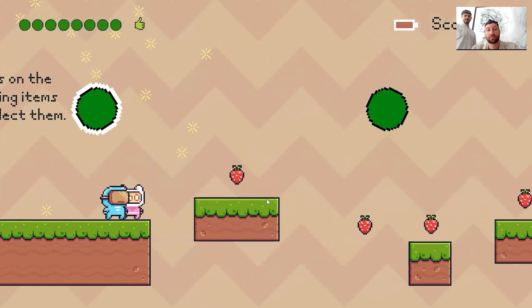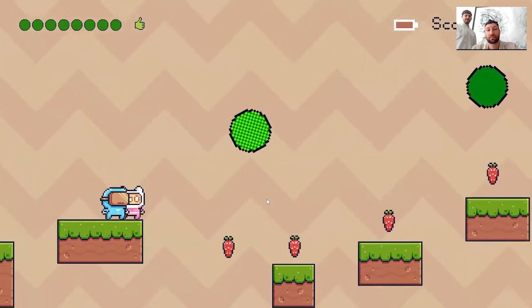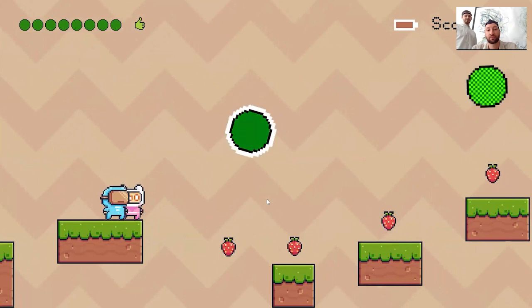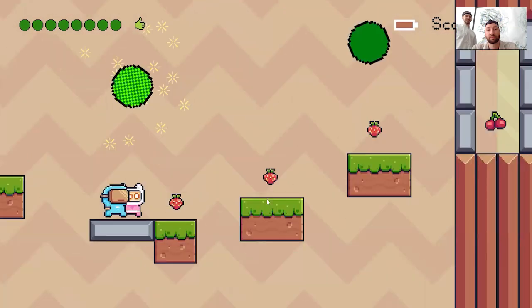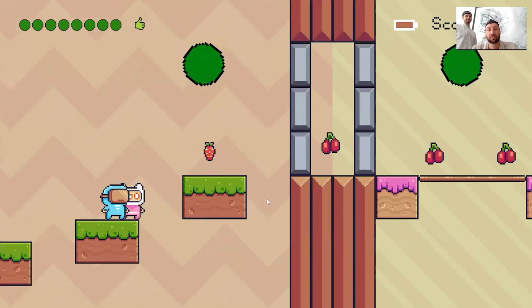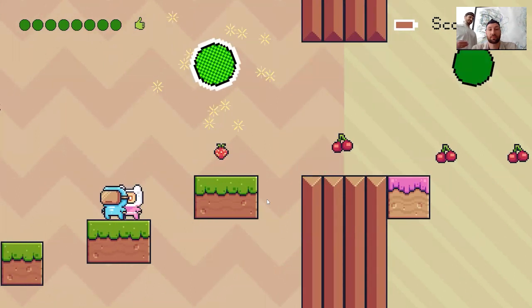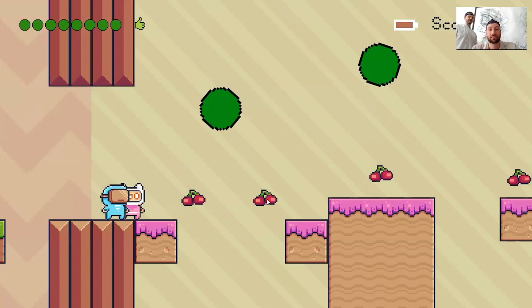Yeah, now he was able to focus, and he was able to move to the next dot. And the better you can focus, the better you can control the game. Right now he focused on the second dot. Third dot, and so on. And only if you can focus well and control the keyboard in parallel, you're able to complete the game.